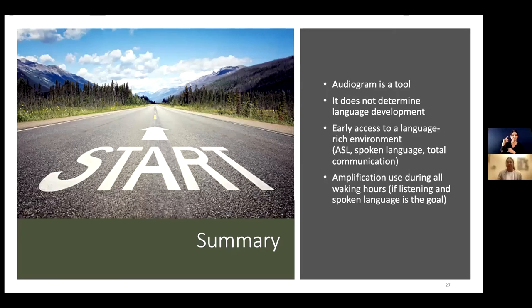Great question. So the best measure that we have for when a child's hearing changes is by doing a new hearing test, seeing what their hearing levels are like on that particular day, and then comparing it to what their hearing levels were like on a different day. That's just a very apples to apples direct comparison.